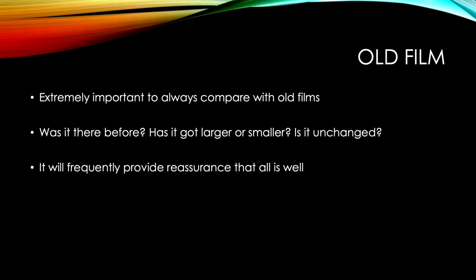Chest X-ray interpretation becomes easier if you approach it systematically. There is no correct way to analyze the radiograph. You should create your own strategy.